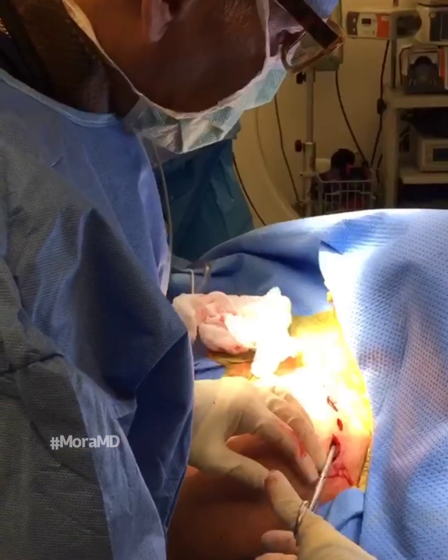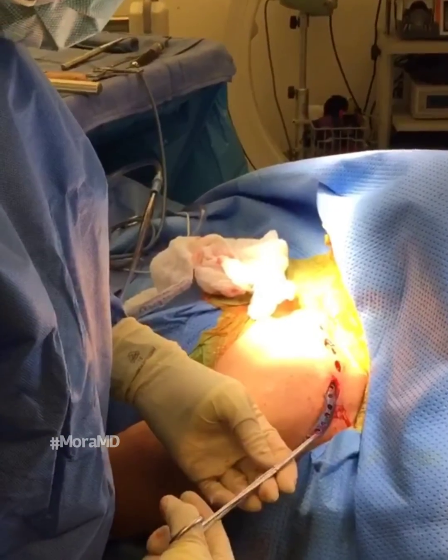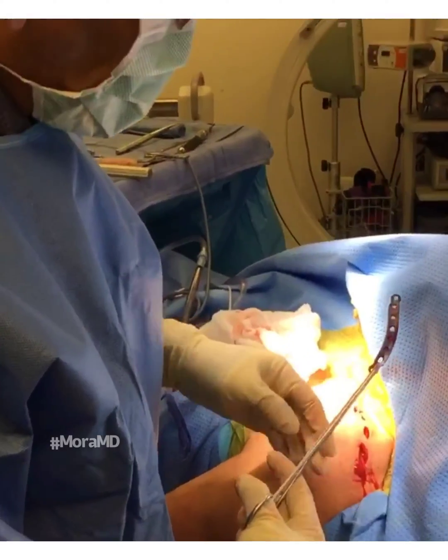It's not easy, especially when they've been in there for a long time. But this is the removal of a clavicle plate. I made small incisions — hopefully it'll heal faster. That's the plate. It's out.